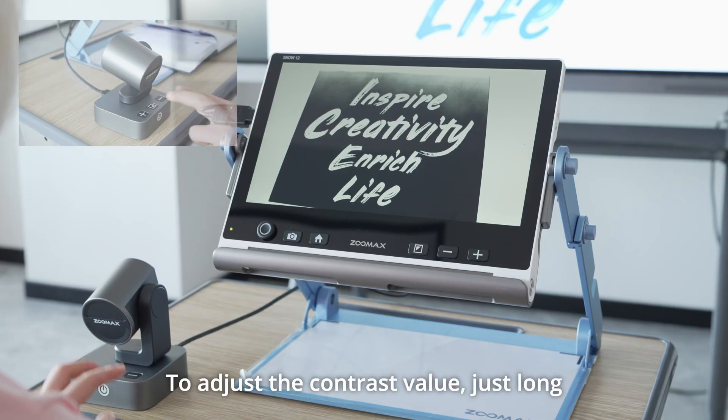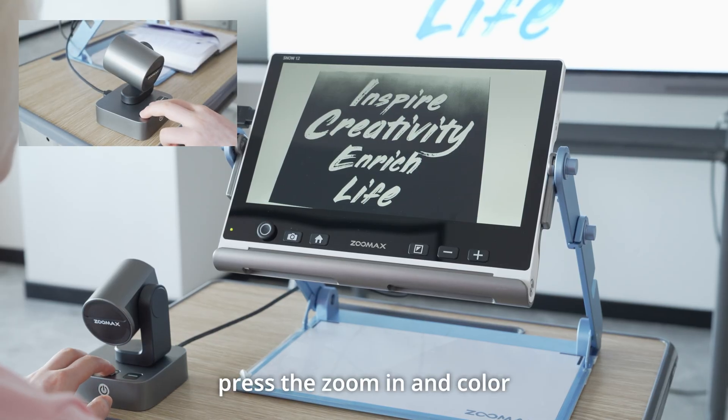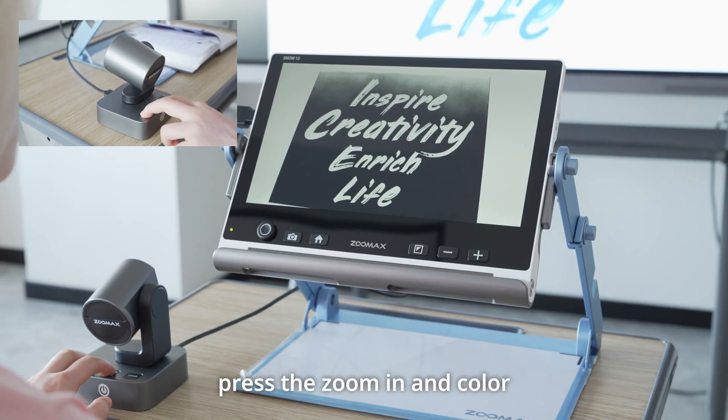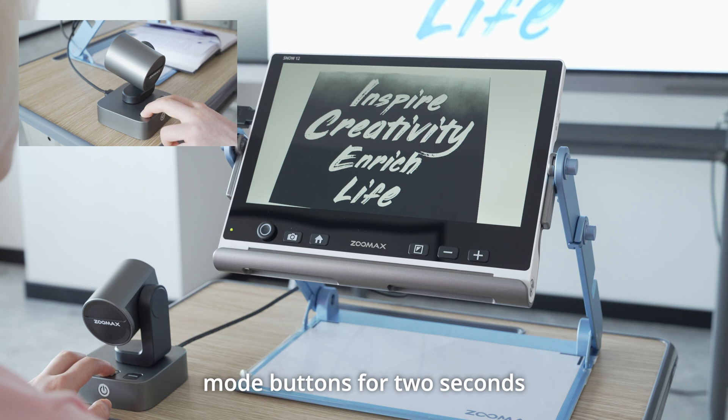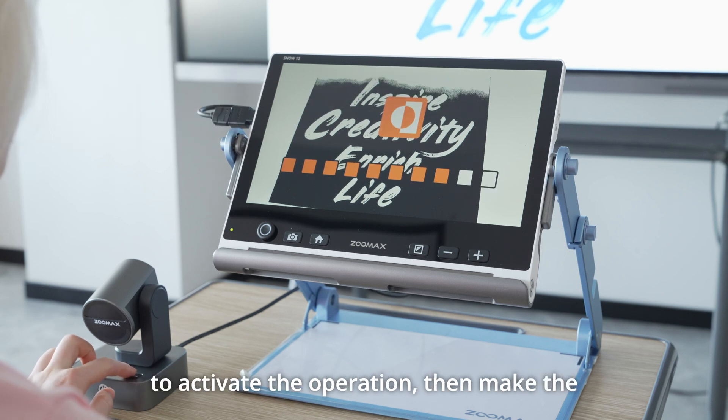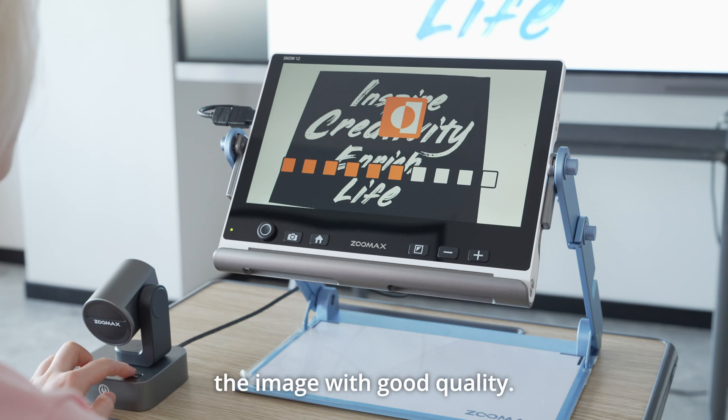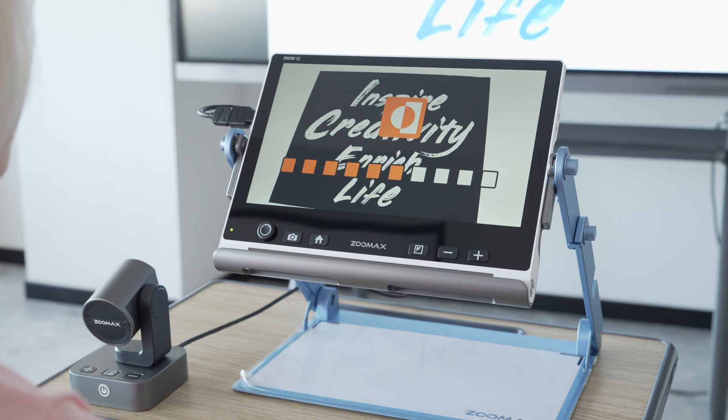To adjust the contrast value, just long press the zoom in and color mode buttons for 2 seconds to activate the operation, then make the adjustment until you see the image with good quality.